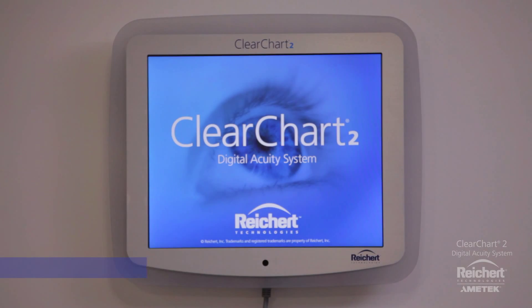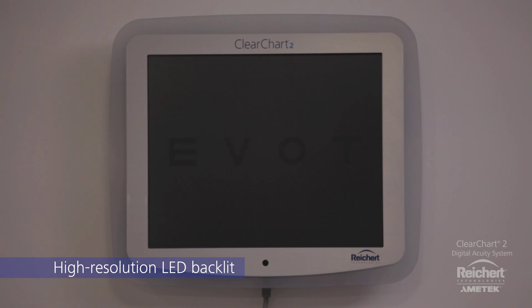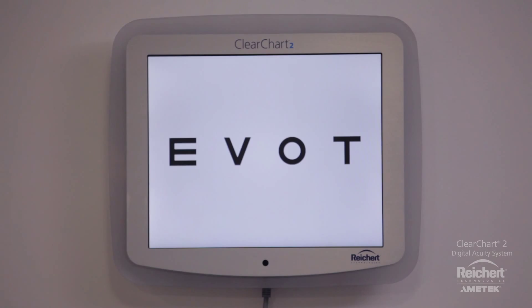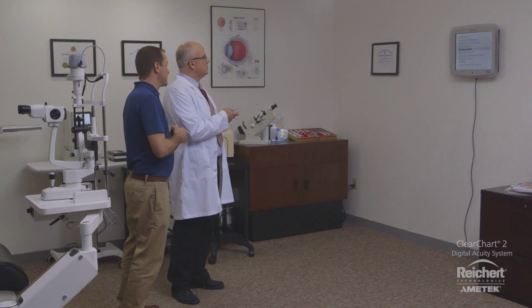ClearChart 2 has a 19-inch high-resolution LED backlit display with three different illumination levels for photopic and mesopic lighting conditions. The easy-to-use remote control allows access to all features and functions from virtually anywhere in the room.